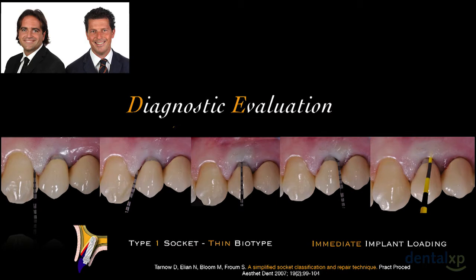And we confirmed this patient as being a type 1 socket with thin biotype, and we decided to go for an immediate implant loading procedure.